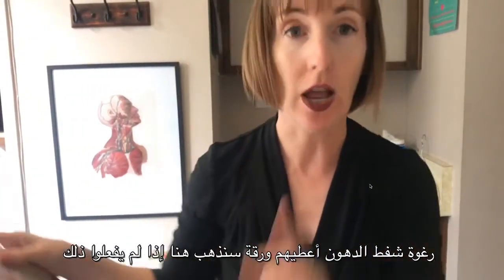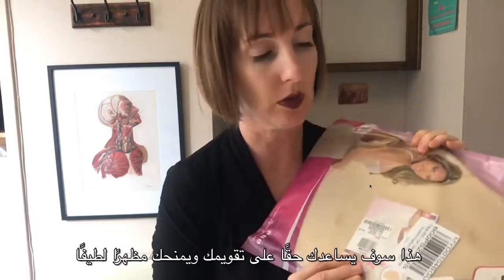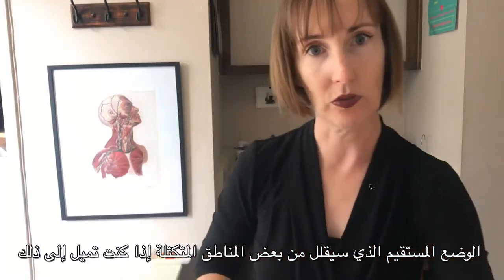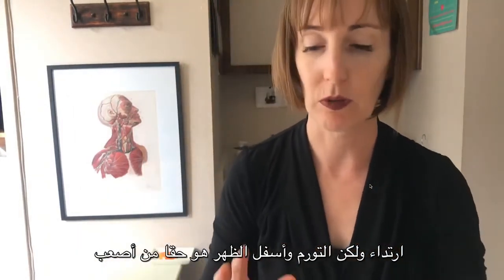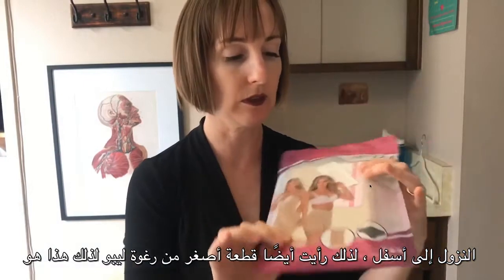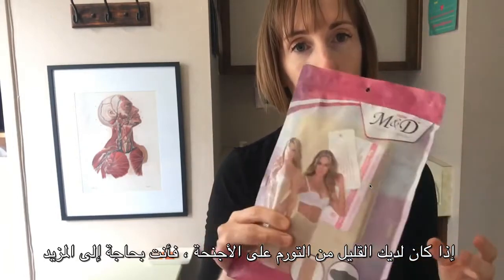Then if they have not had a tummy tuck, if they don't have a scar, if they've just had liposuction, we can see if an ab board will help. I have a few different sizes of abdominal boards. This will really help to straighten you up and give you a nice straight posture, which will reduce some of the lumpy areas. And if there's swelling in the back, there are a few different sizes of lumbar boards — though I've heard from clients these are not the most pleasant to wear, the swelling in the low back is really the most difficult to get down. I also have a smaller rectangle piece of lipofoam that comes in a package of two, good if you have a little bit of swelling on the flanks and need more foam coverage.